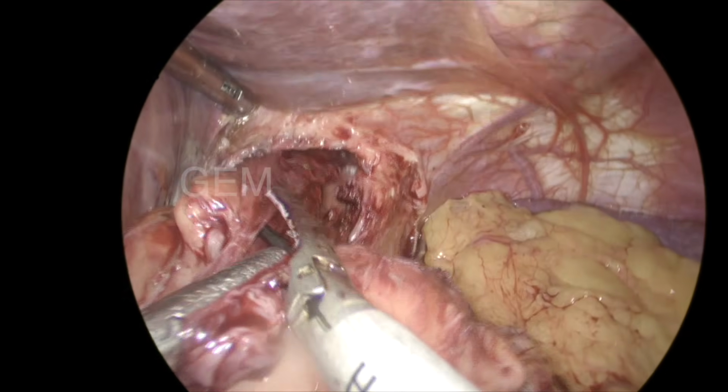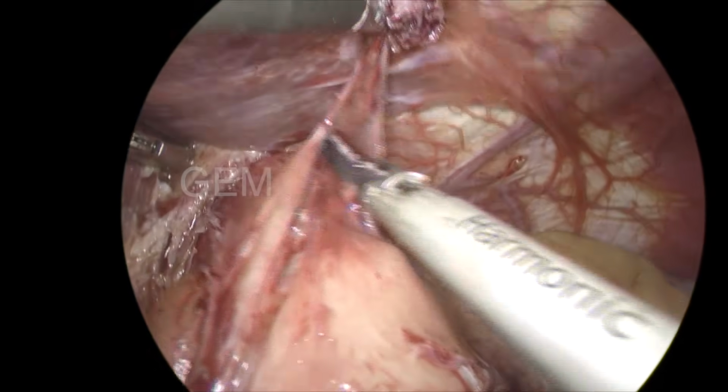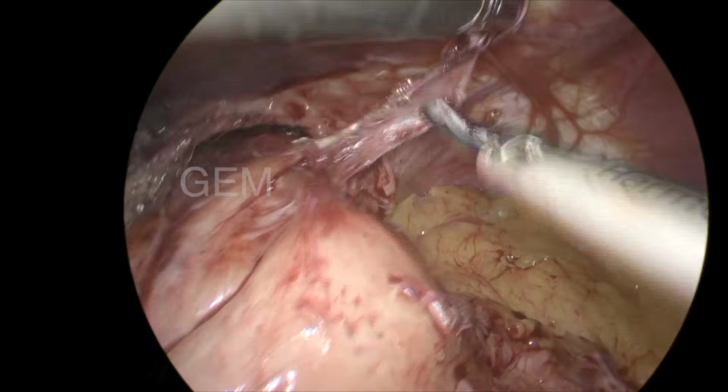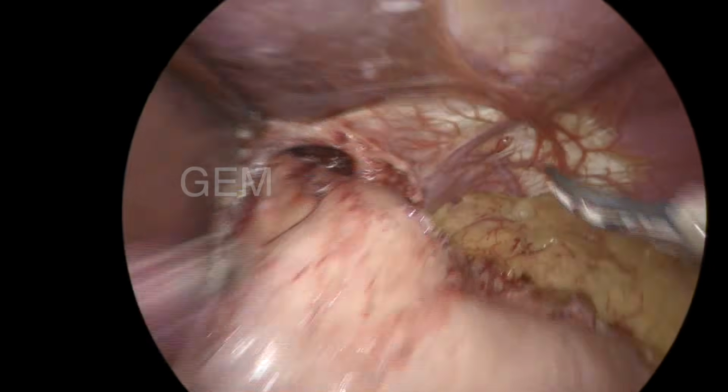Now you can see the hiatus inside. Inside is completely mobilized. The left side of the esophagus has become straight now. So I excised the sac completely. That is considered very important in paraesophageal hernia. So this is also almost the same as a paraesophageal hernia. I excise the sac.